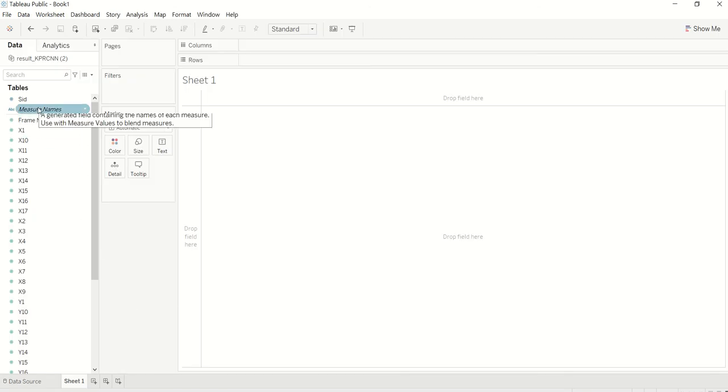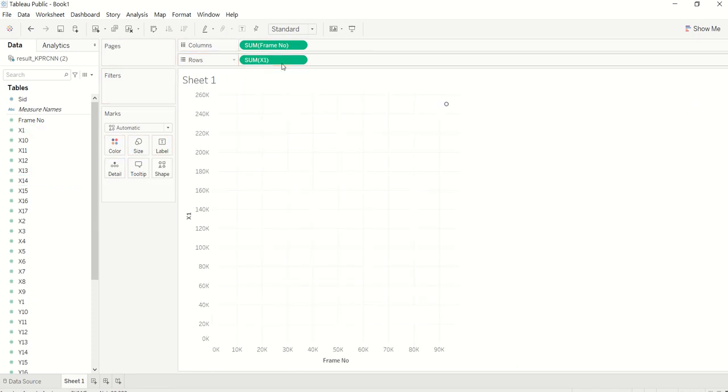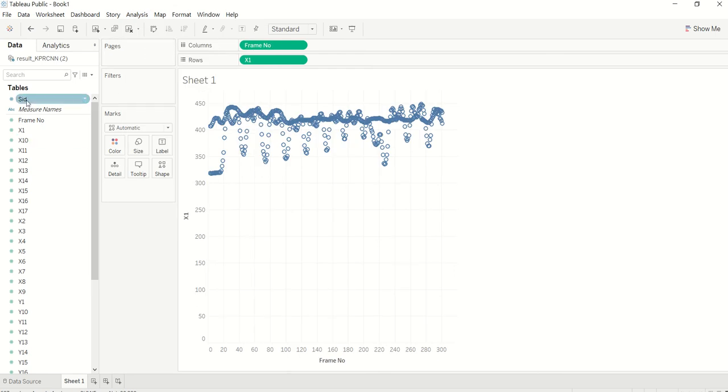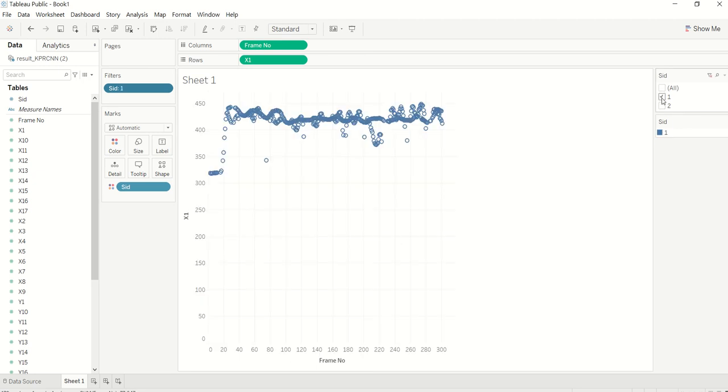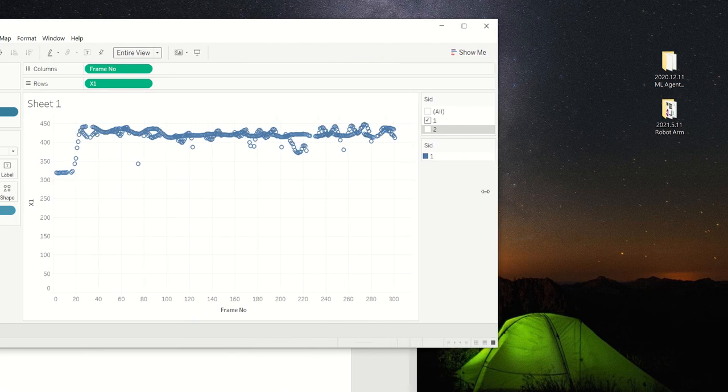For example, I want to take a look at x1. Remember to uncheck aggregate measure, because now we have two subjects, so we put the subject in different colors. Also, I show the subject as a filter. Now suppose I want to look at number 1 or number 2. I always recommend using Tableau to quickly take a look at your data.